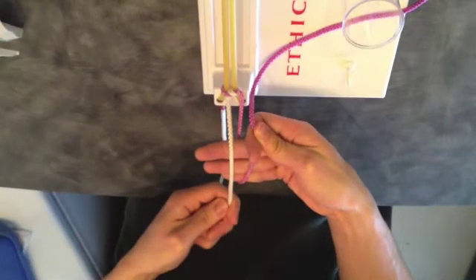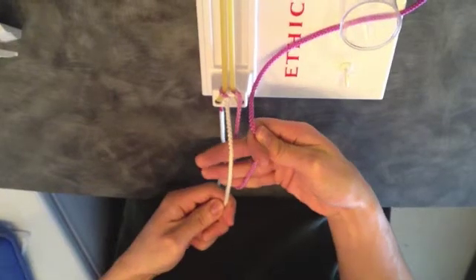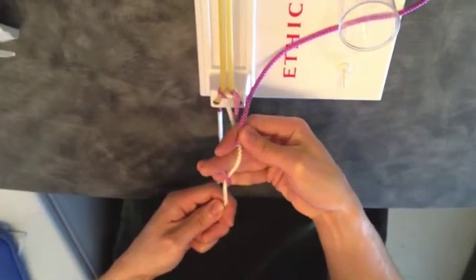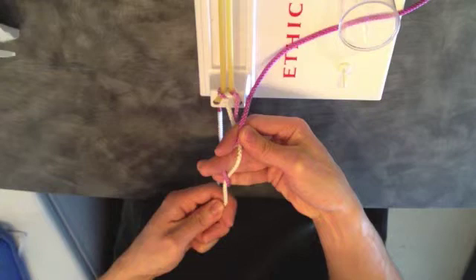Bring your hands back to center. This time, flip the strand in your right hand over your fingers. Grasp the strand in your left hand with your right middle finger. Pass your right middle finger under the strand held in your right hand.